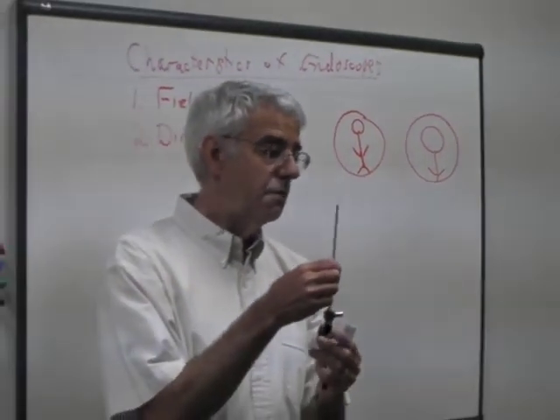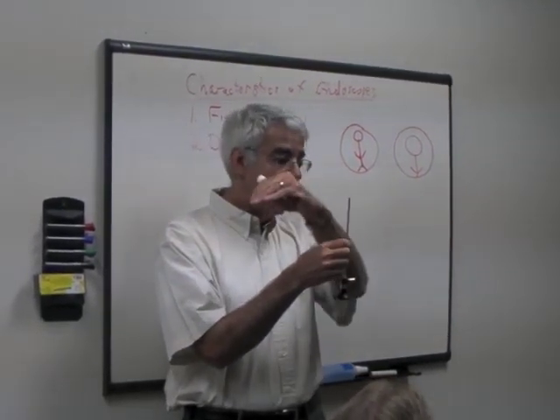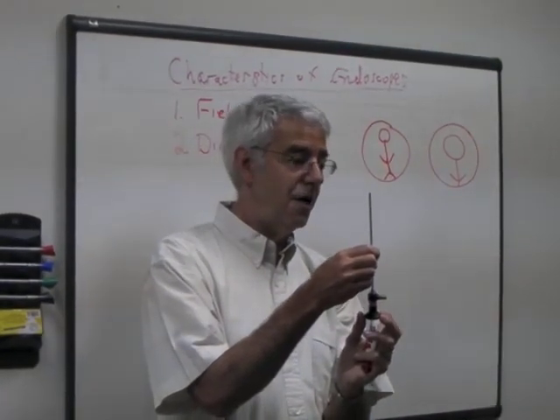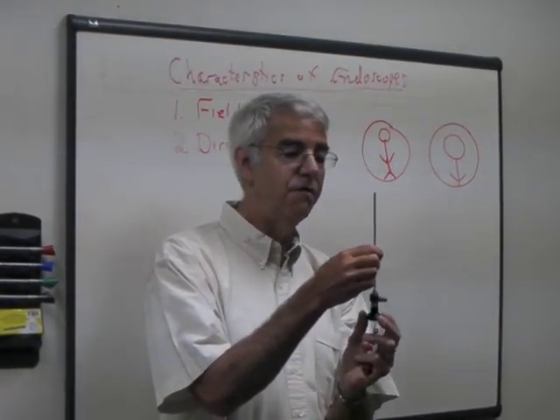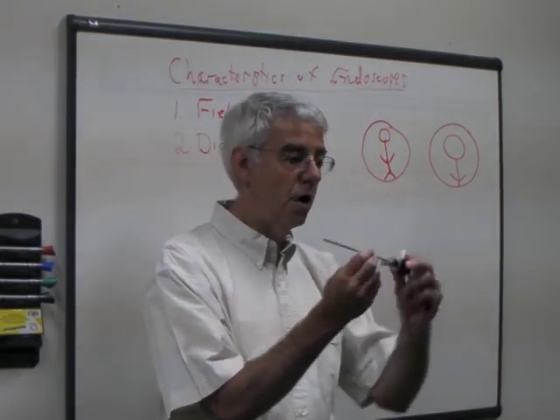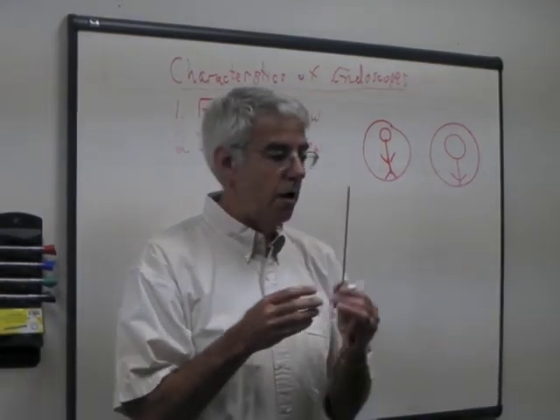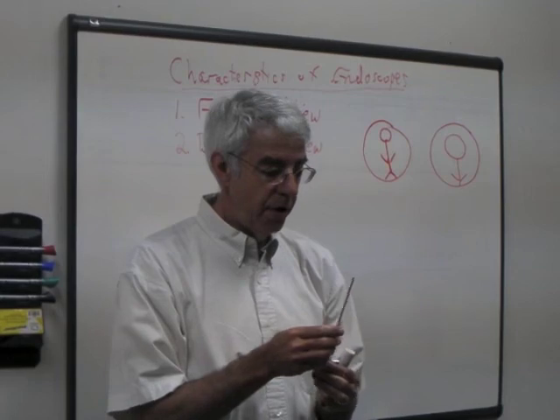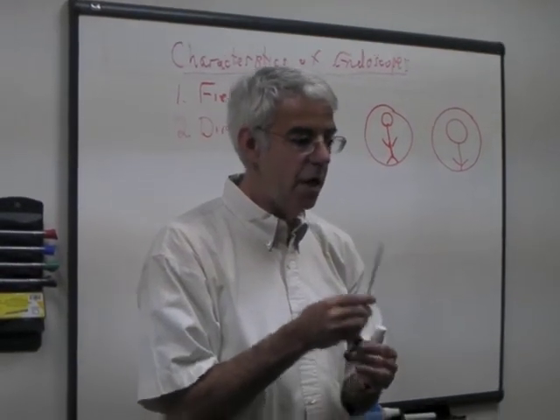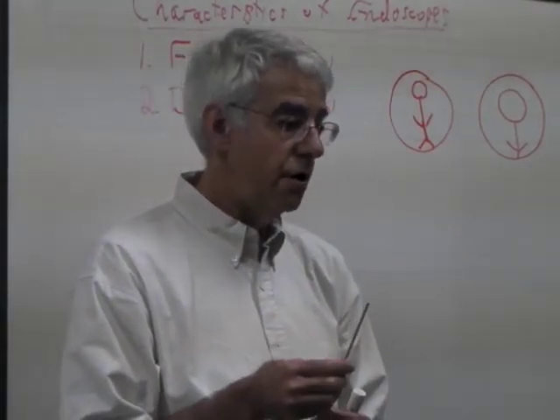What this allows the surgeon to do is look to the side of objects and also effectively increase the field of view by being able to rotate and scan around without having to move the endoscope. So again, an arthroscopist with an arthroscope in the knee wants that consistency. When it's a 30 degree scope, it should be 30 degrees.